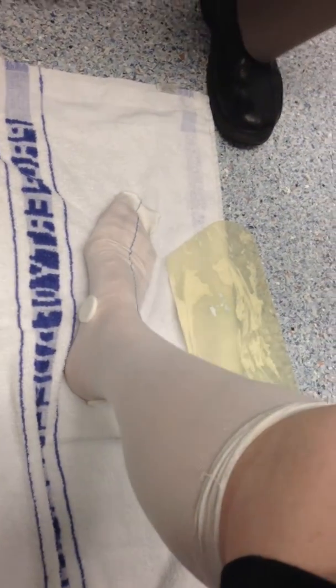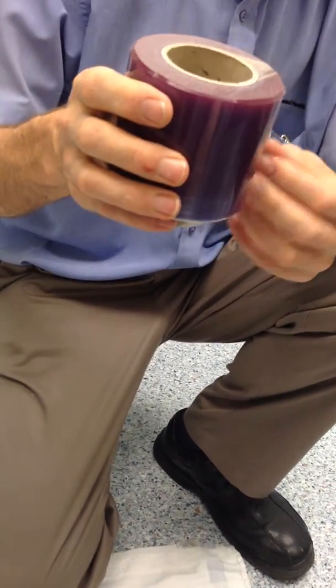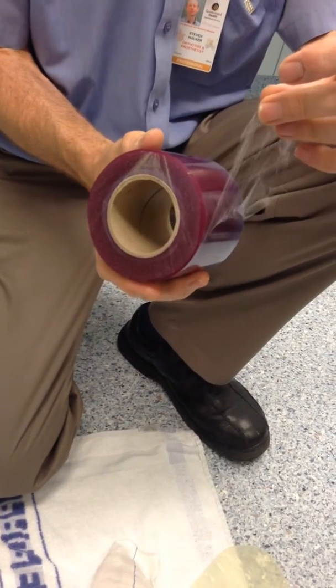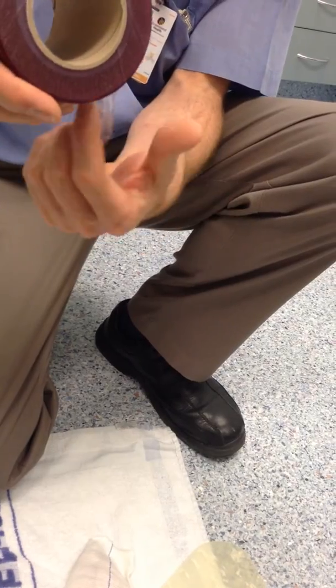And then we can stick a little bit there. What's that stuff? Glad wrap. It's a big roll — it's like a catering size one. But we just chopped it down.